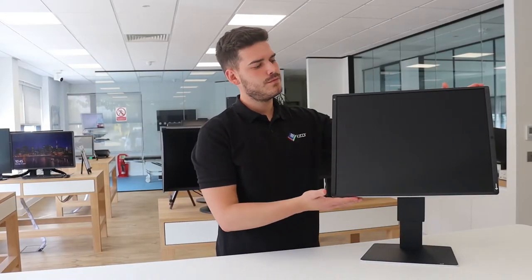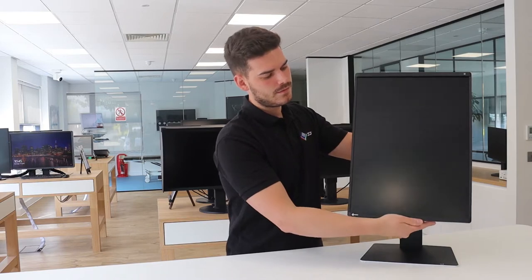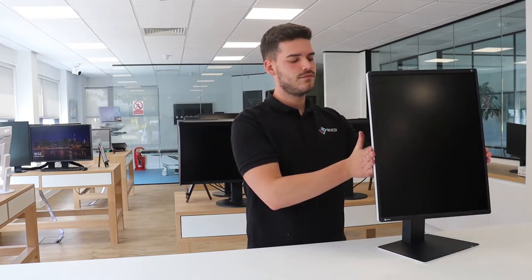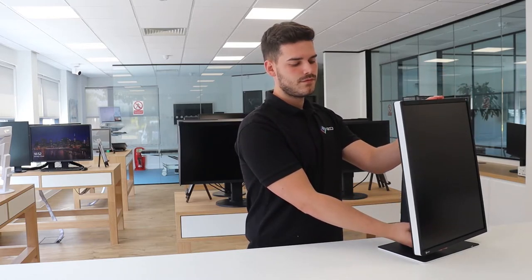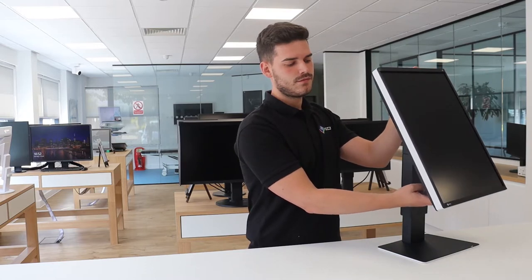The base allows the monitor to be tilted and turned as well as operated in landscape or portrait form. The seamless height adjustment starts from the very bottom on the desk, guaranteeing optimal ergonomics regardless of whether you are standing or sitting in front of the screen. Despite its maximum movement possibilities, the FlexScan base always remains completely stable.